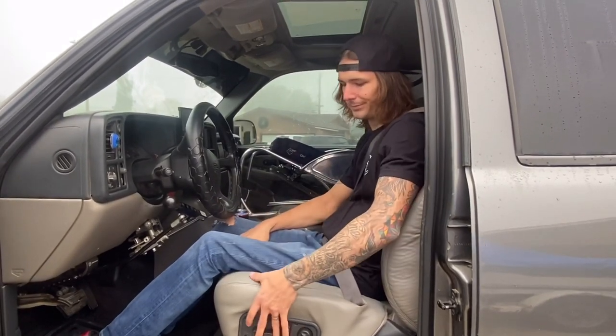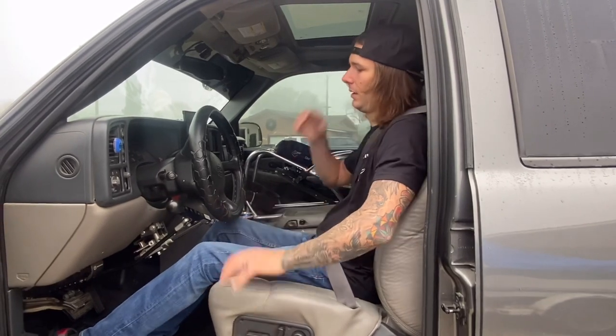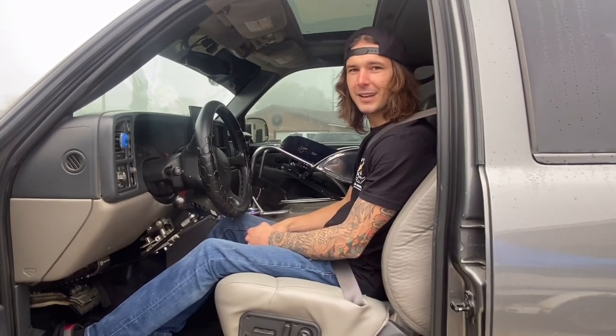And we're in, ready to go. Next I'll show you how I get out.